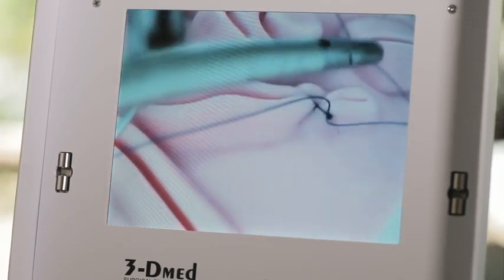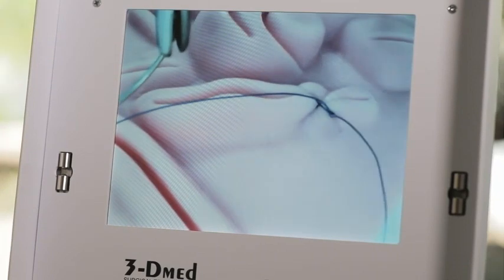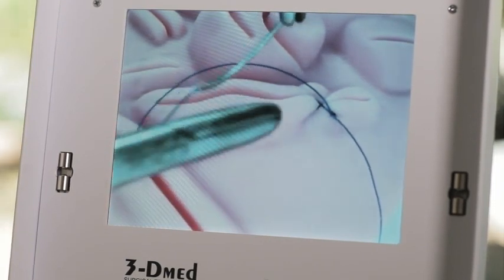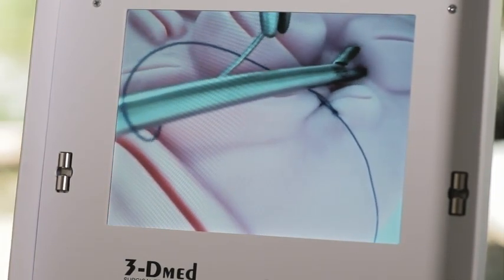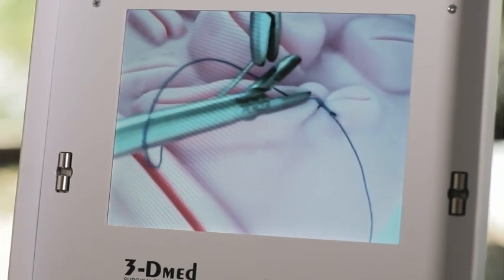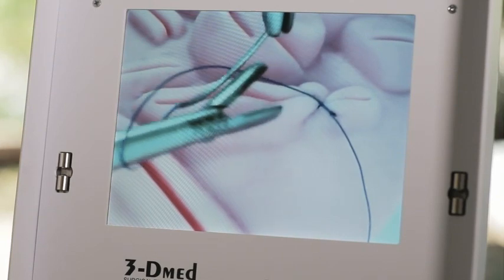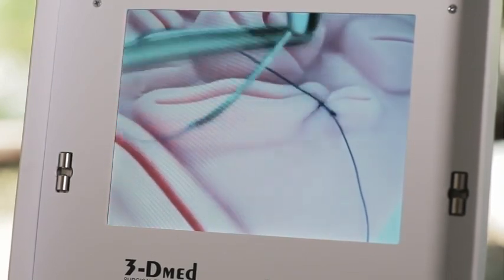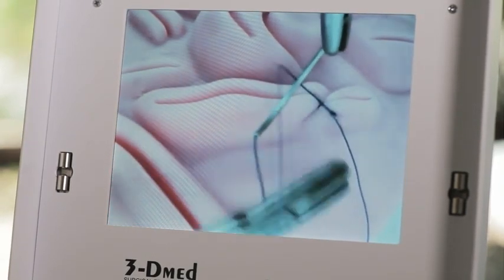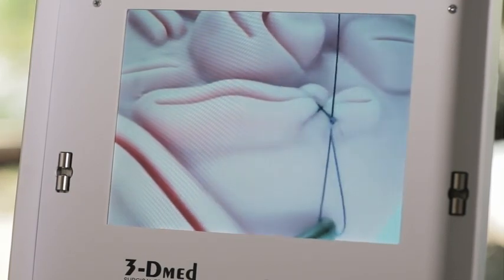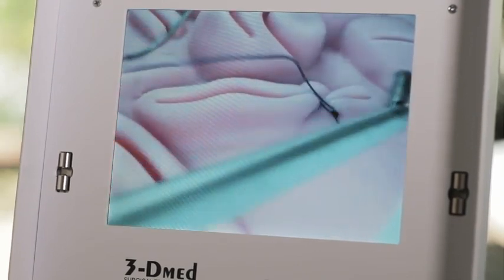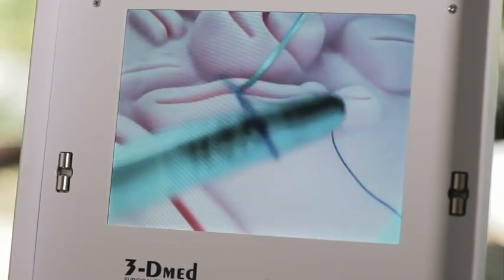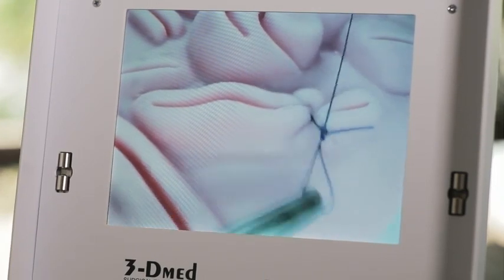Anticipating future knots I'm going to put the loose end on the tissue but it won't stay. I can wrap one final time. In real life if you do have to go moving around, move the entire needle driver complex together so that we don't disgorge our tie. Then I'll pick up the loose end, and there's our third tie and our final fourth tie.